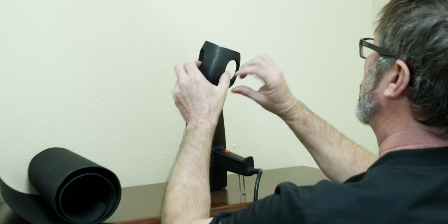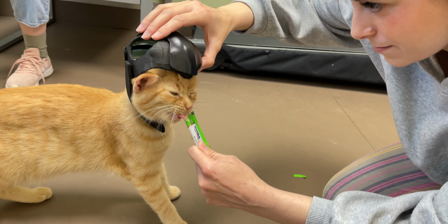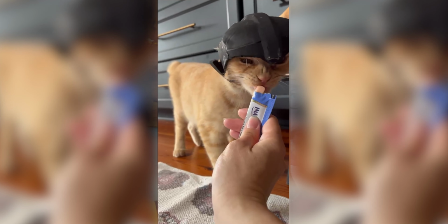When Dr. Yates first came to me to make a helmet for Leo, I made a generic cat head helmet because I hadn't seen him before. Funny enough, that prototype actually fit his head somewhat. It was a little too big and didn't fit very tightly, so when he'd move or shake his head, it would move around as well.